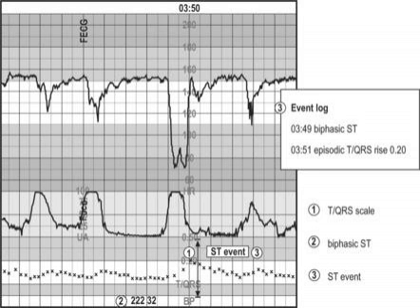They were very smart about it, and they parsed the trial into 3 phases. In the first, they just recorded the number of cesarean deliveries done for fetal distress alone, and for fetal distress with labor dystocia. This served as a baseline for the study. They then trained the participants how to apply and interpret the pulse ox machine, and then monitored the use in 15 to 25 labors. Only then did they start the randomized trial. Now, I highlight all of that just to say that they really thought this study through and tried their best to reduce the number of confounders.